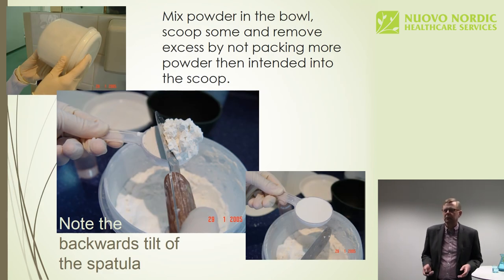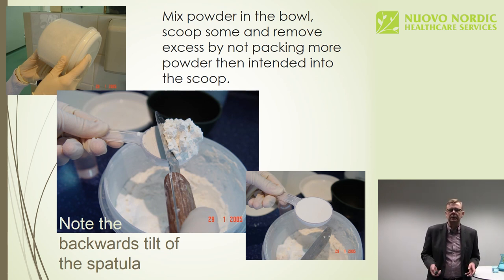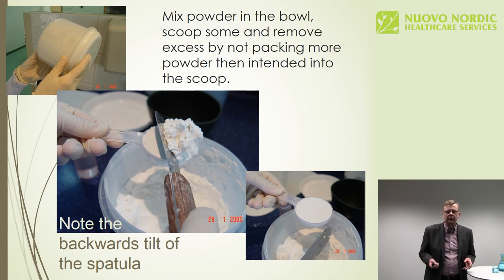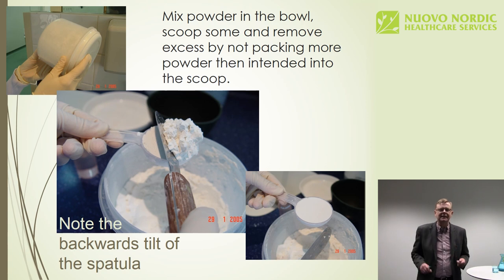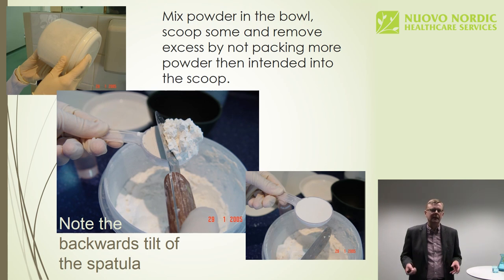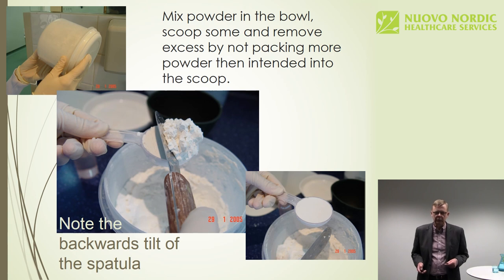What is important, especially if you want to make a good alginate impression, is that you measure the powder accurately, according to the manufacturer's instructions. After you have shaken the powder in the container and scooped up an amount of powder, you just remove the excess by tilting the spatula backwards. In that way, the spatula won't pack too much material into the cup. This is how the manufacturer has instructed us to measure an accurate amount of powder.